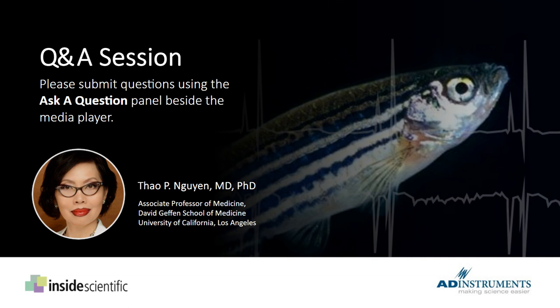But as I said, if you need to record for longer than 15 or 20 minutes, we would really suggest looking up the literature to know how to provide fish with ample oxygenation, hydration, and you also need to provide a little bit more of Tricaine maintenance.